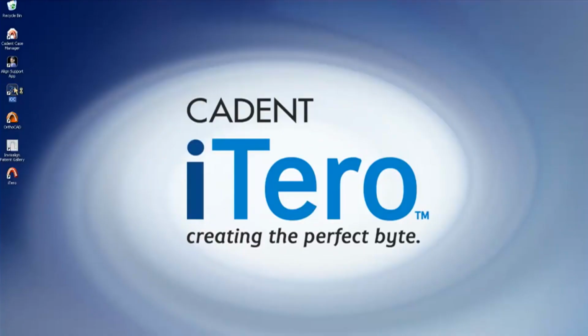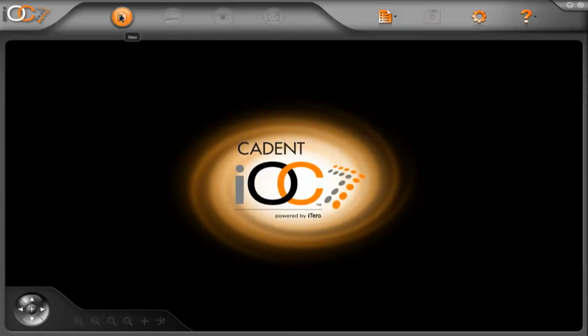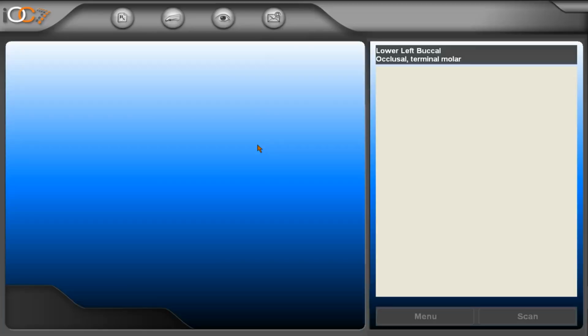Now, double-click on the IOC icon, which will open the scanning software. Once the scanning software opens, to start a new patient, click on the Rx button, fill in patient details, and select the case type. Once ready, press Scan Now.